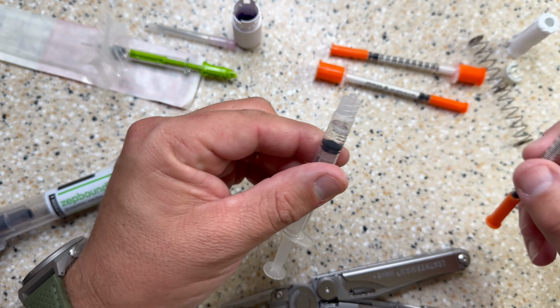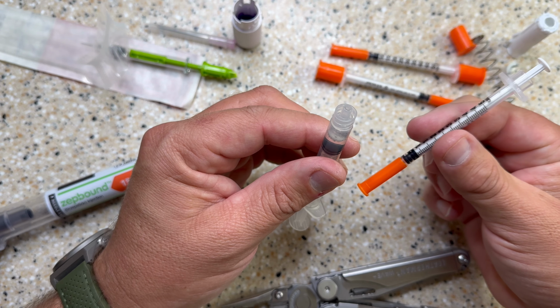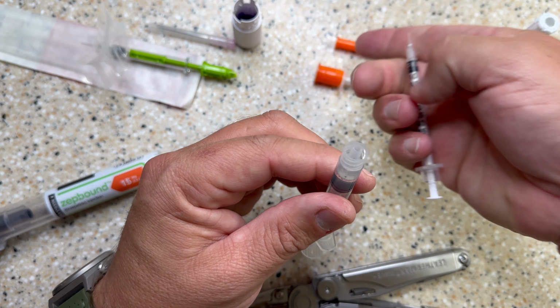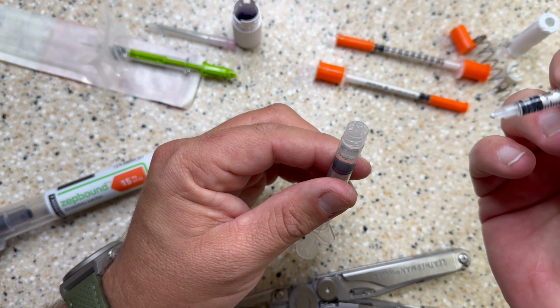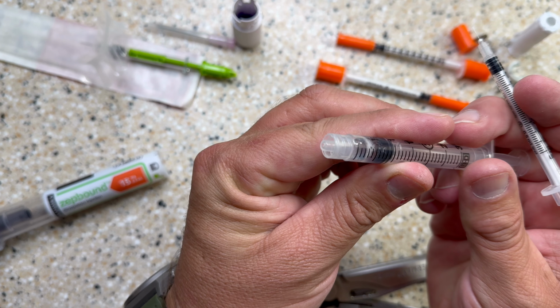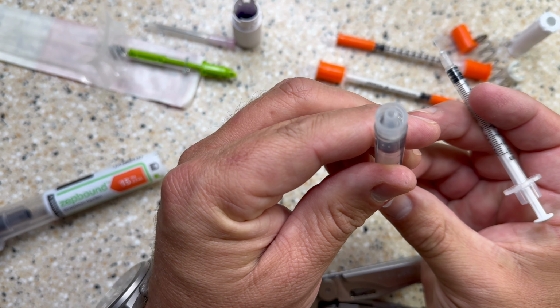So what I do from here, I take one of these 50 unit insulin syringes. And you can see they're really easy to inject here because of the super small needle. And the idea here is to get the product up into the neck.